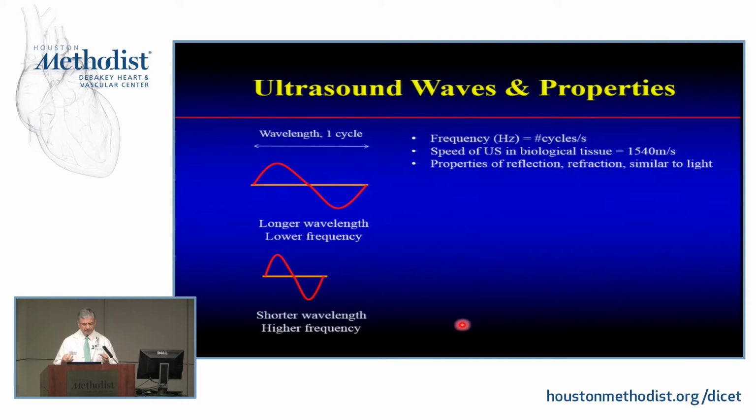So a few basic things. One is this is a wave and it is usually defined by its wavelength, okay, and its amplitude. So the wavelength that you see there is called a cycle, one cycle of a wave. The amplitude can be an oscillation, wide oscillations as opposed to small oscillations, okay? And you could see the longer wavelength versus the shorter wavelengths. And there's a definition of frequency. The frequency is the number of cycles per second, and that's hertz, okay? You talk about kilohertz and megahertz.